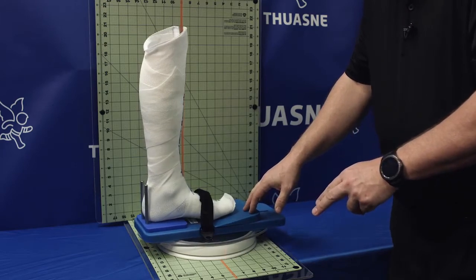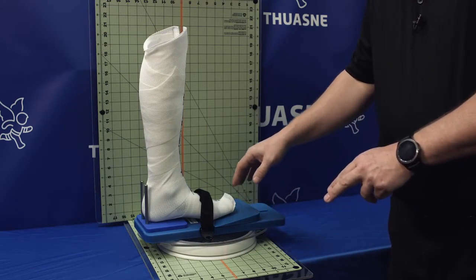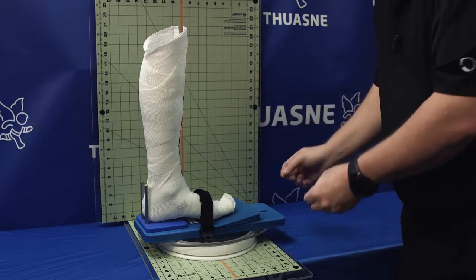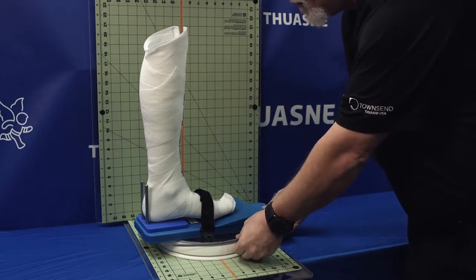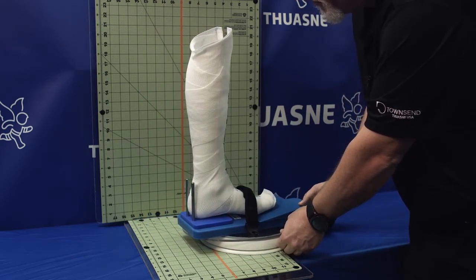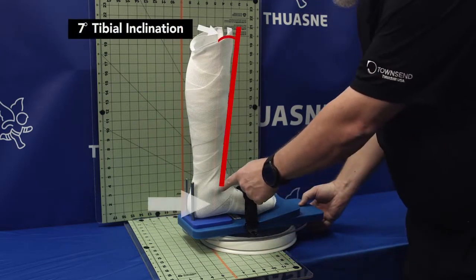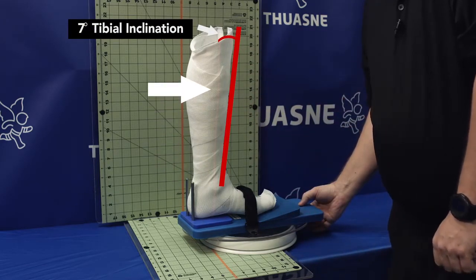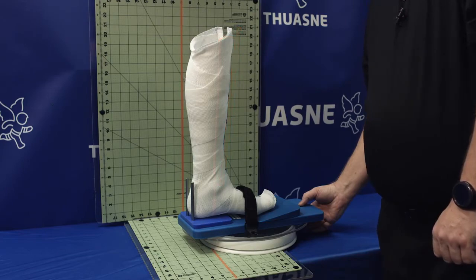So now we know that the hind foot is aligned correct, the forefoot has great alignment, and then the last thing that we're going to check is sagittal alignment and make sure that the tibia has a 7-degree inclination based off of the heel wedge. So we'll just slide this over and you're going to be able to see that we're at the center malleoli, we're at center of the calf, so this is properly aligned in the sagittal plane as well.